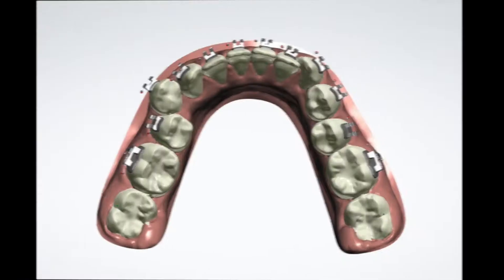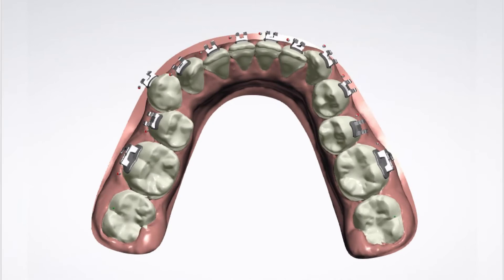The process starts by sending an impression to the lab, or you can send an intraoral scan of the teeth and opposing jaw to check the occlusion. The lab is then informed about the brackets you want to use. In this case I was using the 3M MBT prescription Victory Series low-profile 022 brackets. You have to be very specific because the brackets must fit the tray, so the computer needs to know the exact dimensions and specifications.